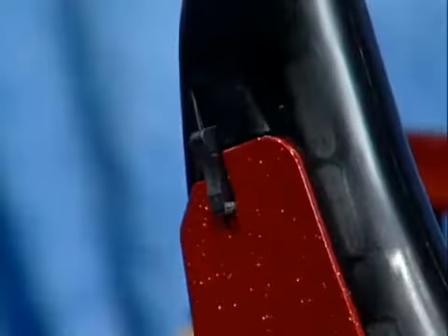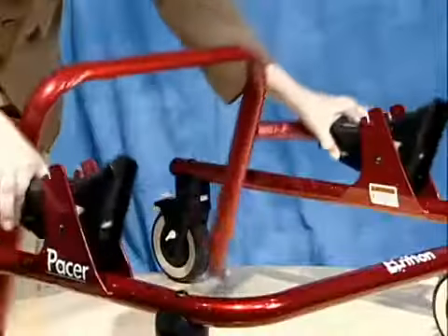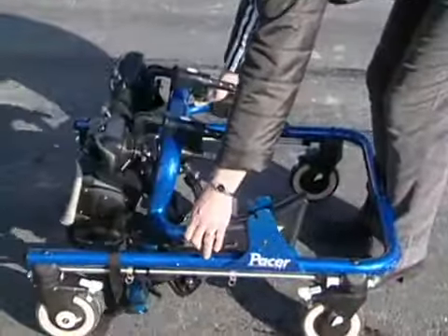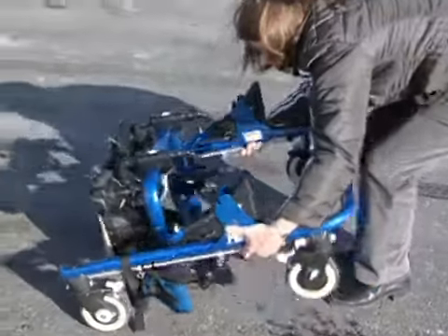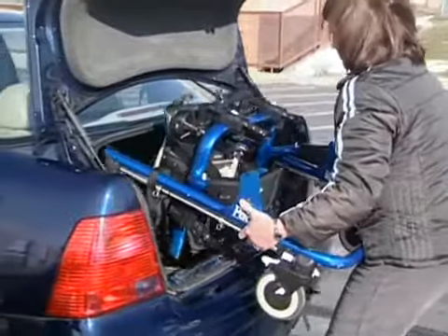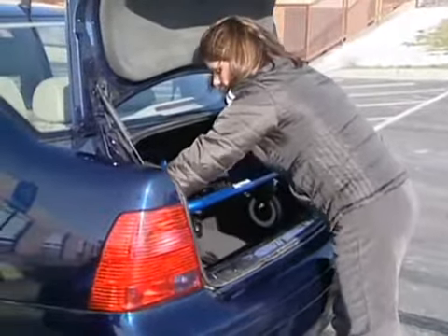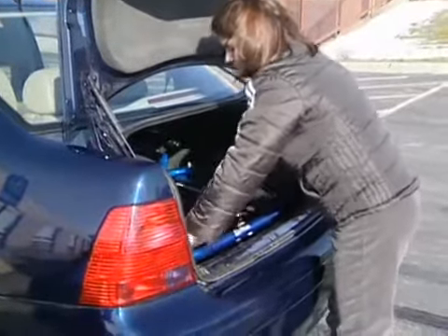Another great feature of the frame are these latches, which enable you to collapse the frame for storage, or to take it home with you. Depending on the size of your car's trunk, you may be able to load it with the prompts attached.